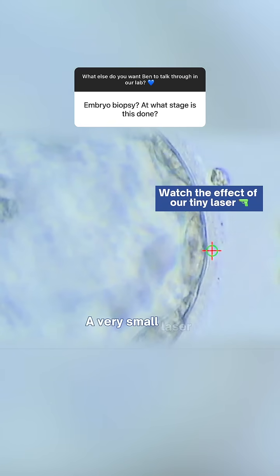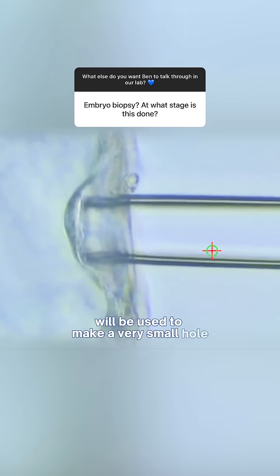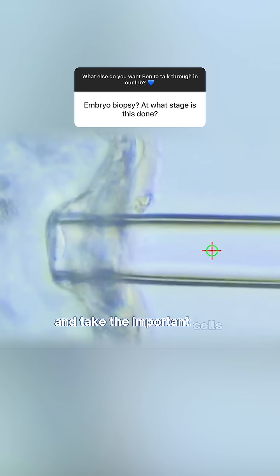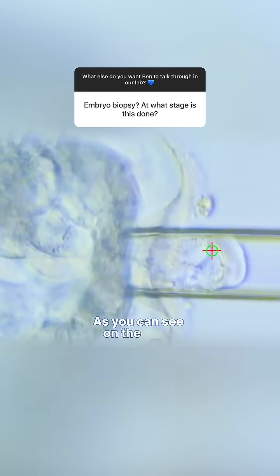A very small laser of 5 micrometers will be used to make a very small hole for the biopsy pipette to go in and take the important cells from the trophectoderm, as you can see on the video.